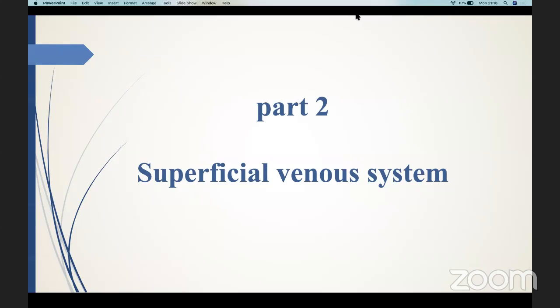Thank you very much for your question. It's a good question. You've got the position called Fowler's position, where you can tilt the couch slightly with the patient lying down, or just bring the head or chest slightly up, semi-sitting, or even scan them standing, using color mode and spectral waveform. You don't have to compress in such cases, because color mode and spectral waveform are more than enough to give you confirmation whether your patient has a DVT or not. Good.